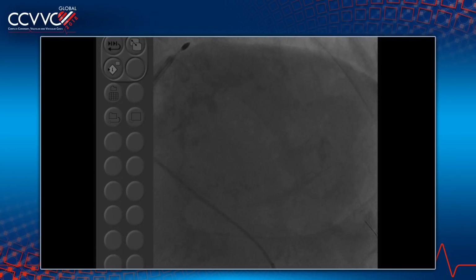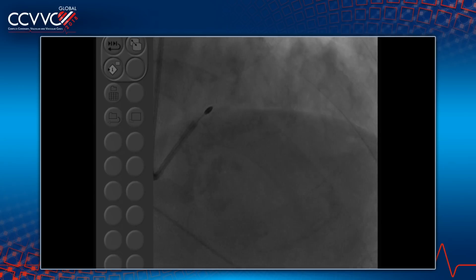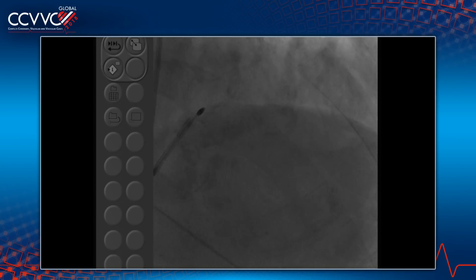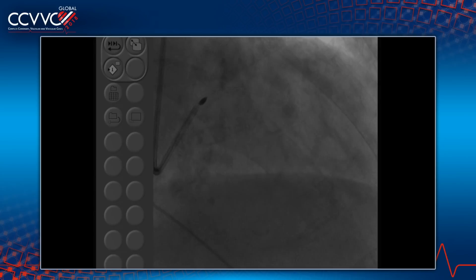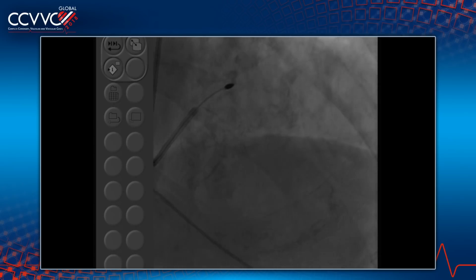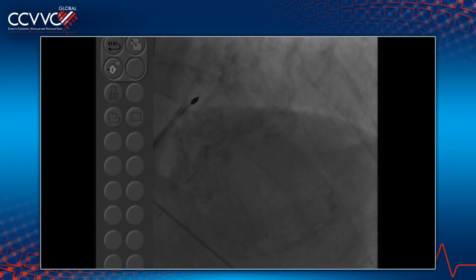Very rarely, in low risk cases, we do a PCI at the same time as the TAVR. But this kind of complex left main would be very difficult to do after the TAVR. We have written a great paper, and we'll talk about the access. That's the problem, he's right. Sam, I agree with you that after the TAVR, of course, it depends what valve you use, but you might have some more trouble accessing the coronary.